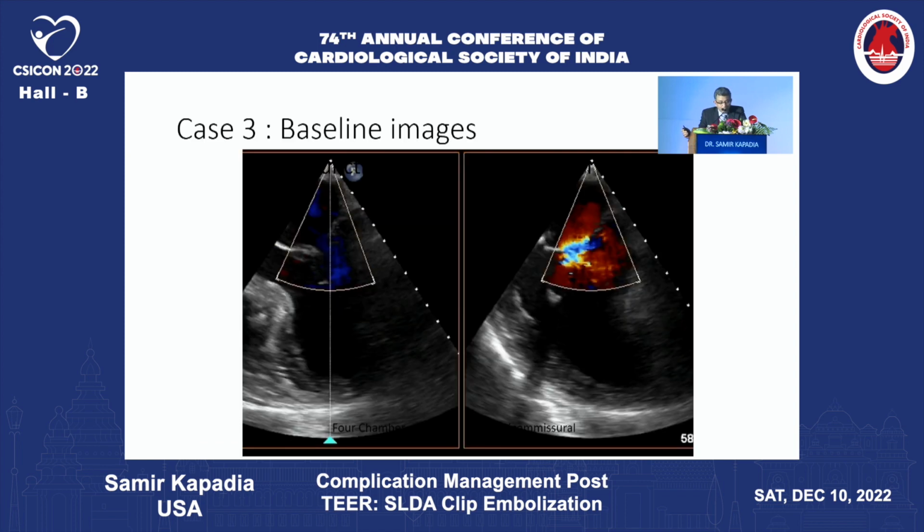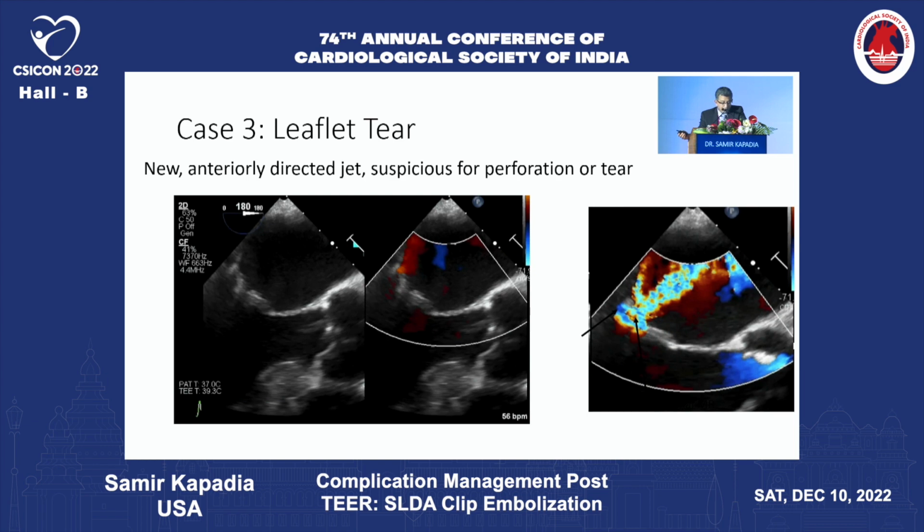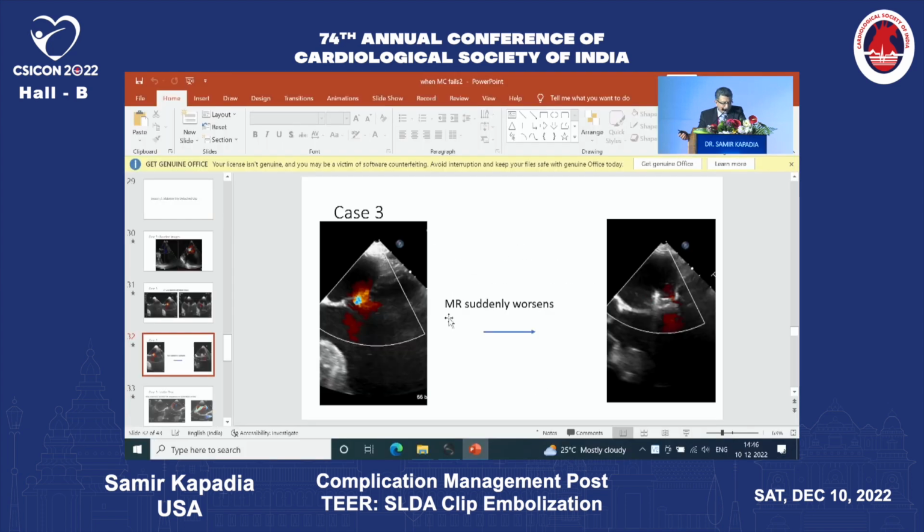This is another patient. This is another unfortunate patient. Can you please click on this one? This is worth seeing. On the left image and then the right image. And if it doesn't play, just escape and restart, because sometimes the computer runs out of memory.